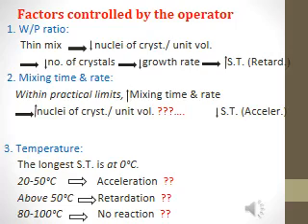Okay. In mixing time and rate, if you increase the mixing time and rate within the practical limit that I told you, you are breaking the already formed dihydrate crystals during mixing, so this will increase the number of nuclei of crystallization per unit volume, and of course this will result in acceleration of the reaction because the rate of crystal growth will increase.